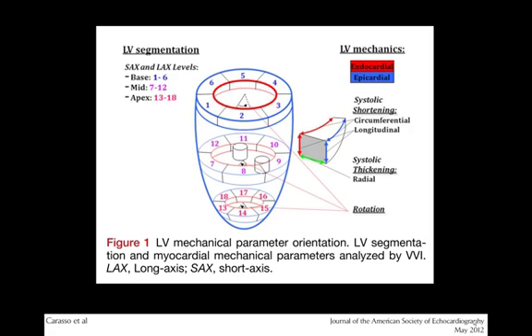To highlight a few very interesting things that we see here in our day-to-day in the lab. It's been a little over 6 years, right at 6 years, of starting the routine use of the package of automatic functional imaging, or basically obtaining global longitudinal strain measures on the patients that come requested pre-chemo and follow up during chemo in the lab.